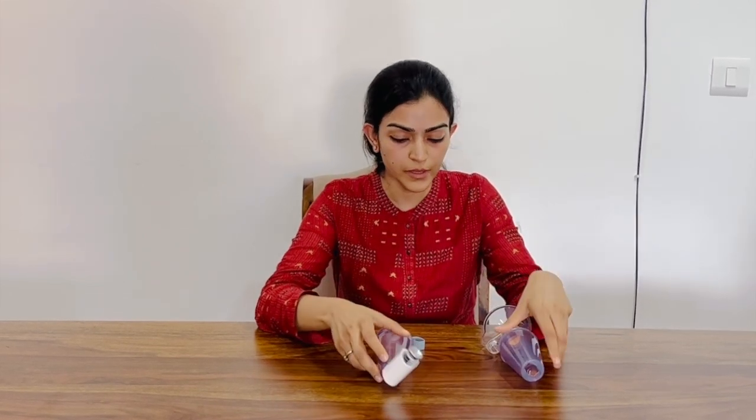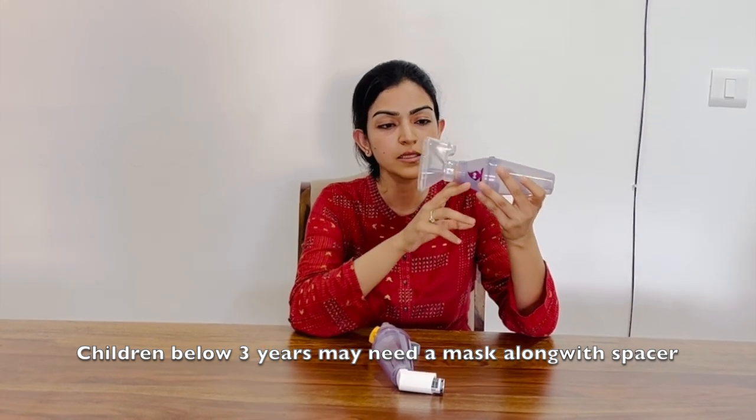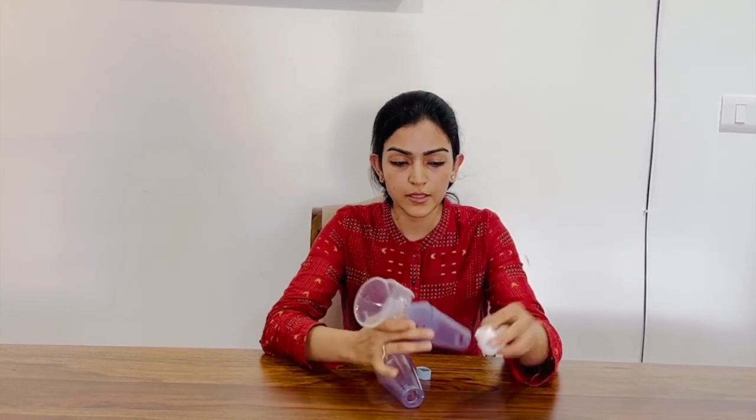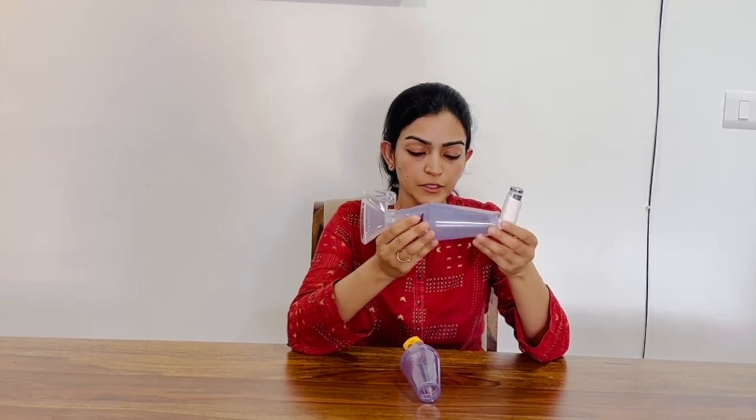For smaller babies who cannot make a seal around the mouthpiece, we use a mask in front of the spacer. The mask has to be placed around the nose and the mouth of the baby. The rest of the process is the same. The inhaler has to be shaken, attached to the spacer, and puffed, and the mask has to be placed over the mouth and the nose of the baby, and the baby has to breathe normally for about 30 seconds for the drug to be delivered.